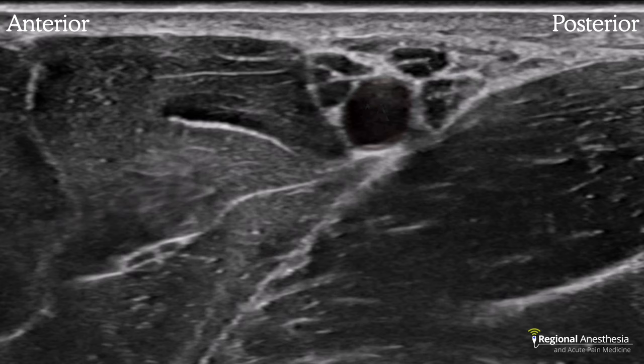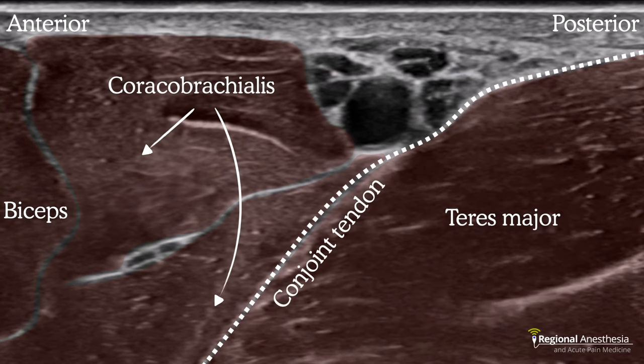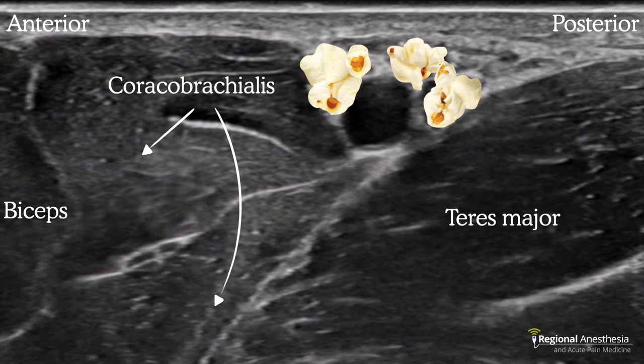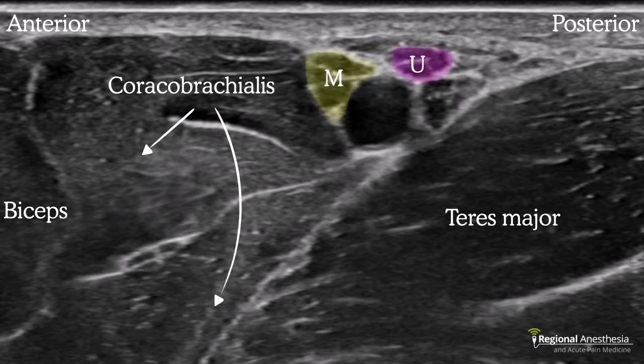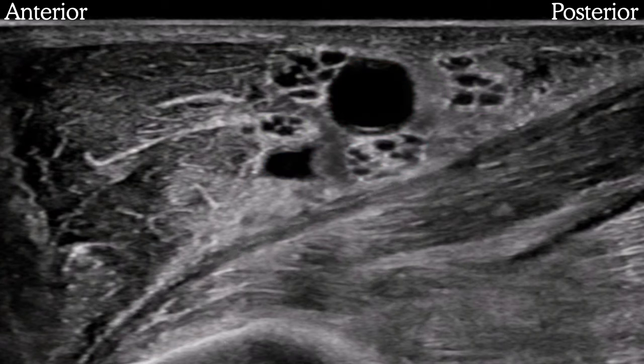Here's a typical sonogram: the axillary artery is centered and quite superficial. On the anterior side we see the coracobrachialis and biceps muscles; on the right is teres major with its conjoint tendon running diagonally across the screen. Three structures that look like pieces of popcorn clustered around the artery are the median, ulnar, and radial nerves in their typical positions. Within the coracobrachialis muscle we see the musculocutaneous nerve with its characteristic bifascicular appearance.